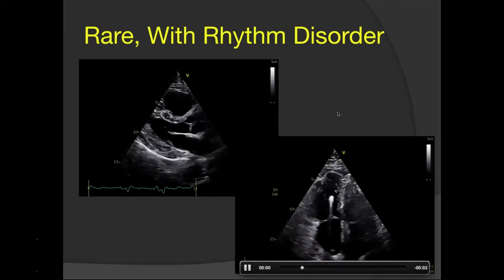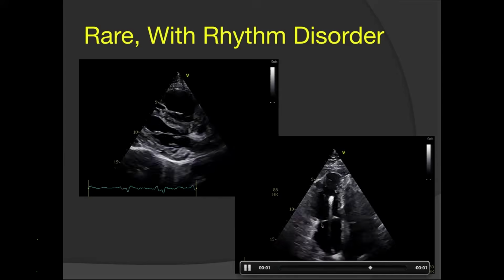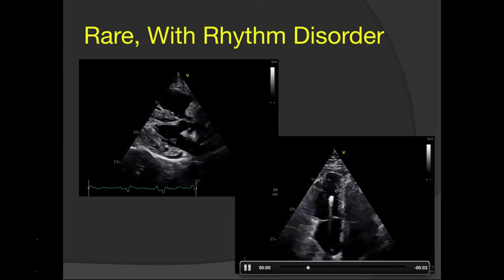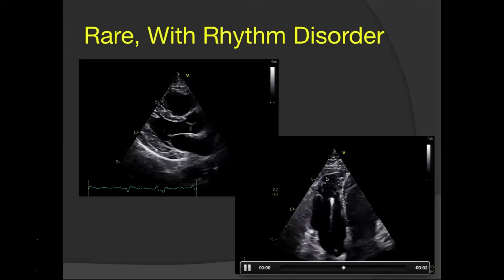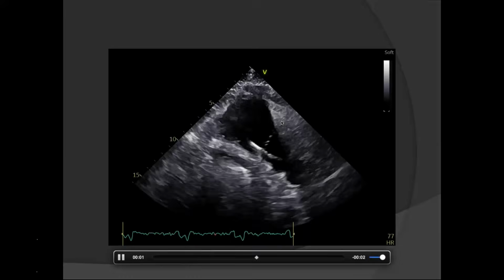So we should not be sticklers to numbers and just views. TAPSE is normal. How can RV be abnormal? You know the limitation of TAPSE. You are seeing motion abnormality in the apical part, clearly an akinetic apex. So we should report that. And the likely diagnosis is ARVC.